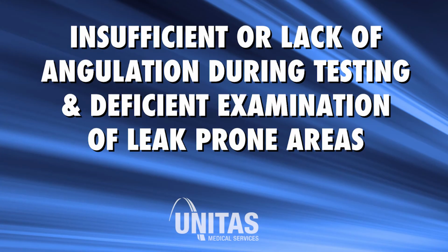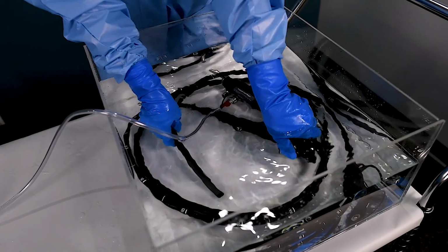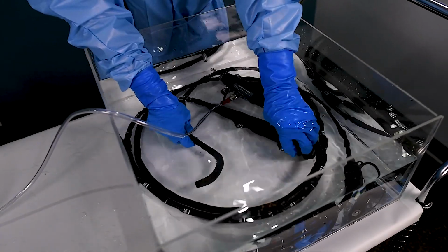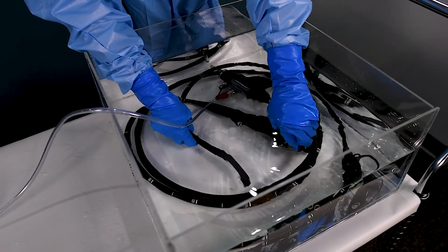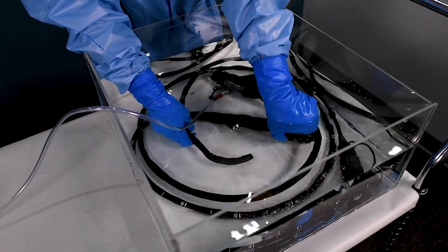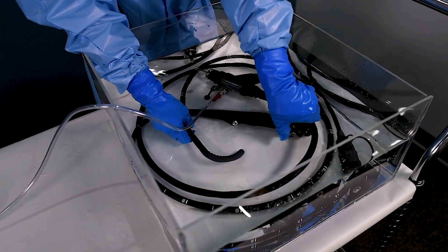Insufficient or lack of angulation during testing and deficient examination of leak-prone areas. All flexible endoscopes need to be angulated during the leak test process. Just visualization of the control knobs, video buttons, and the distal end may obscure or mask leaks without the proper full angulation in all directions.